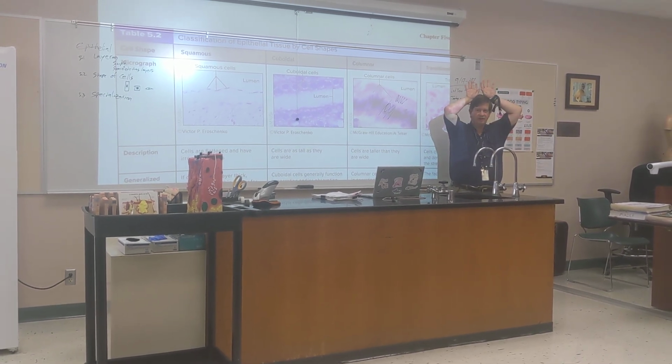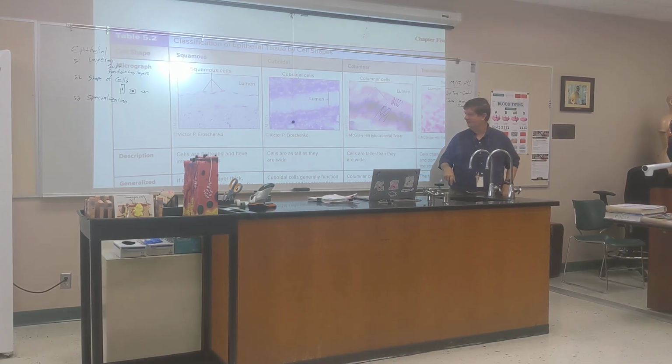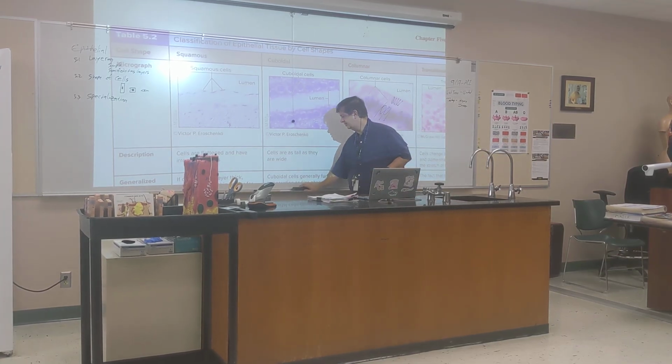Whole bunch of microvilli for surface area. This is intestinal tissue. Does that make sense? Okay. All right.